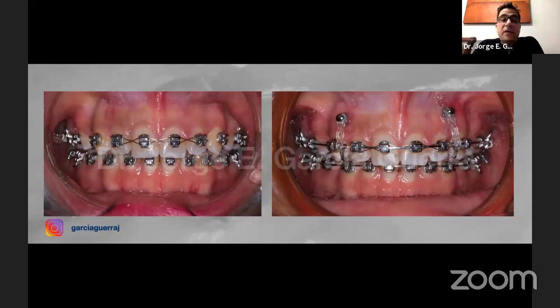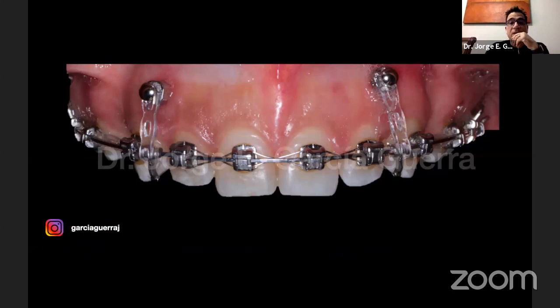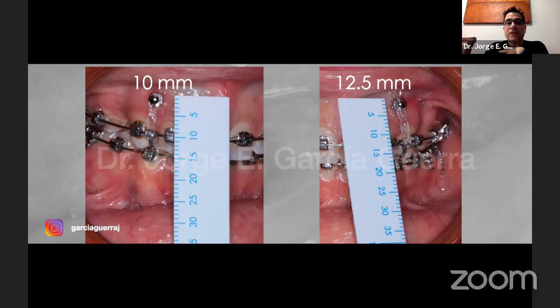And this is where we put them. You can see that I missed, they're not at the same altitude. So that was an error of mine. But what we're doing here, we're going to put very slight forces so we start correcting the overbite. Now, as the treatment progresses, you're going to start seeing that I created an open bite. I always measure the distance so I can be evaluating the treatment. Here you can see how we're going to intrude.